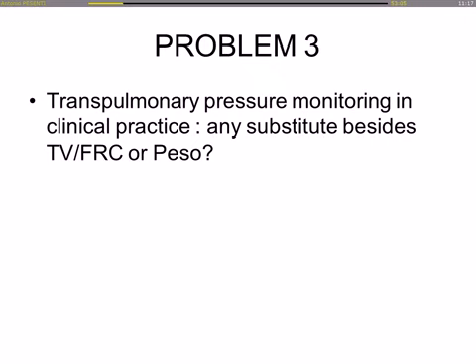It does not require paralyzers. If you have a paralyzed patient, don't attempt spontaneous breathing. But it might be bad too. And after all, we like to know how the patient feels, how much dyspnoic he is, and most of all, we like to tailor how much the patient is working and how much the ventilator is working. We don't care much about the energy expense of the ventilator, but we should care about the work of the patient.